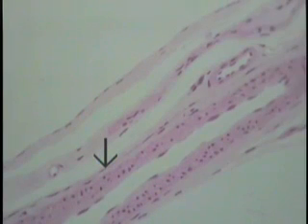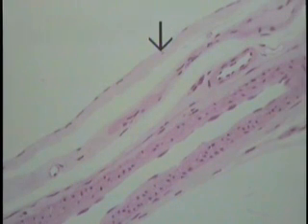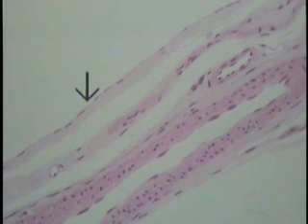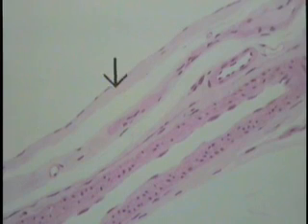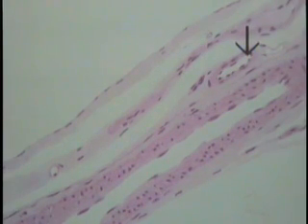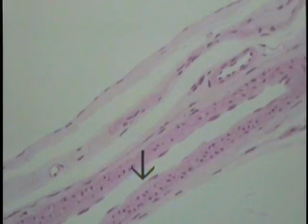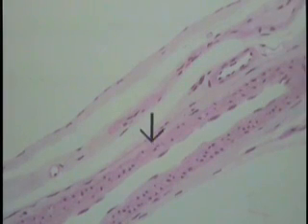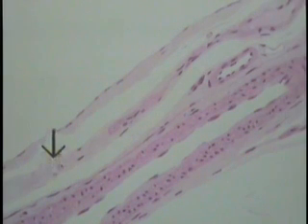Situated in the same field of view, if we go back to the medium power objectives, one can compare the two types of simple squamous epithelia: the mesothelium lining the external surface, which is actually the visceral layer of the peritoneum, and endothelium lining this small vessel here, which is a form of simple squamous epithelium, as well as this larger vessel, in this case a small artery. Also in the field is a small capillary at the end of the pointer, lined by a single cell of endothelium.